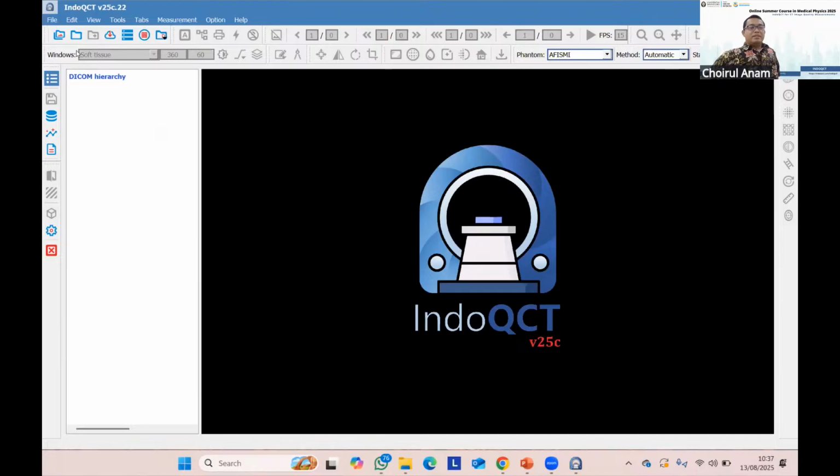In the IndoQCT, this button is for opening the image file by file, and this button is for opening the images using a folder, and this one is to connect to the PACS system, and Mr. Aris will explain this tomorrow. And this one is to make the computational phantom, and we will explain it in the second session.